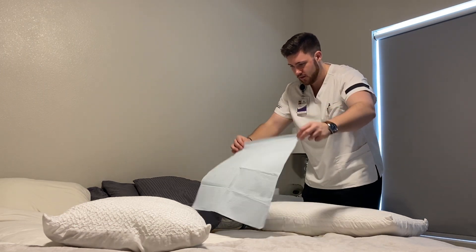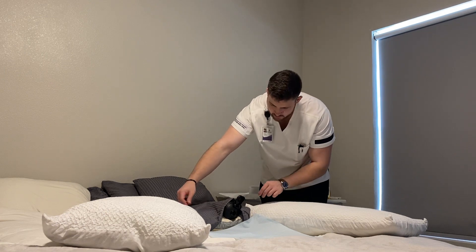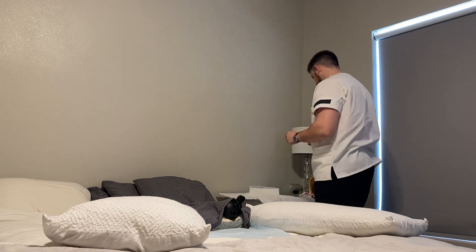Place the drape shiny side down. Generally, we come behind the patient and reach in between their legs on the outside in order to pull it up, but since they're pillows, I'm going to go like that in order to get under the client's buttocks.